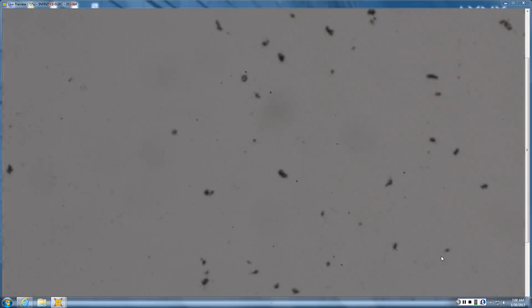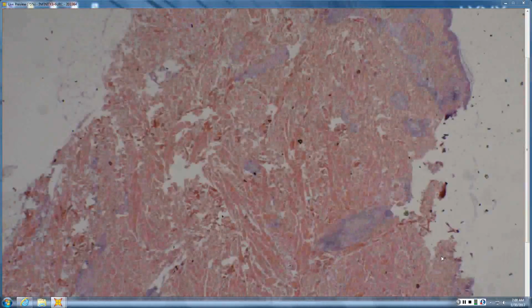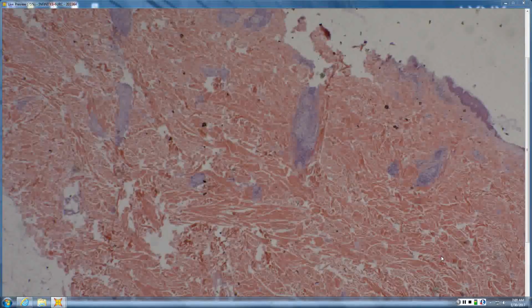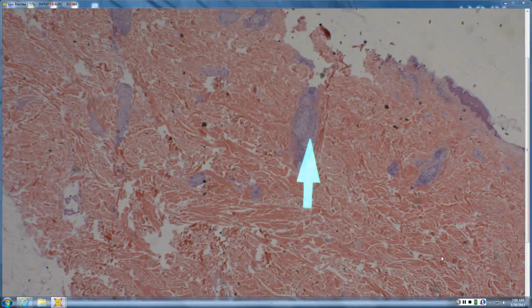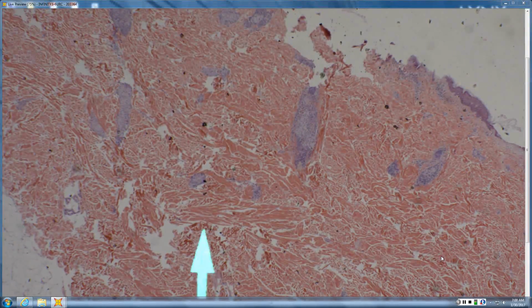Okay, number 3. This one is tuberculoid leprosy, so the paucibacillary form, and usually from scan, we see the skin, the epidermis, and you see what appears to be, you're thinking, oh, maybe this is like a perivascular infiltrate, but it doesn't look quite right. It doesn't look like lymphocytes per se. There's a lot of cytoplasm, so you're kind of thinking more histiocytes.